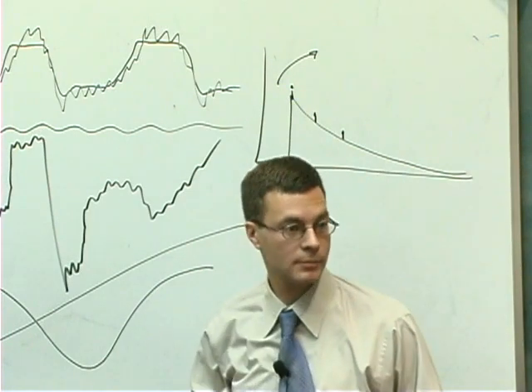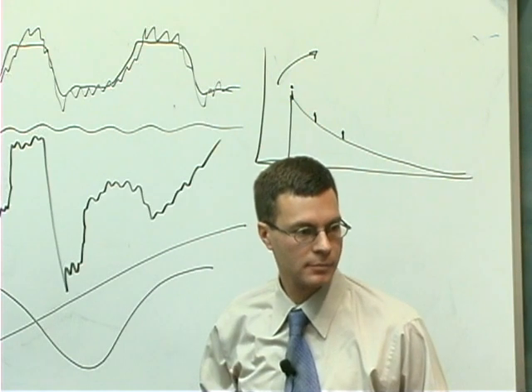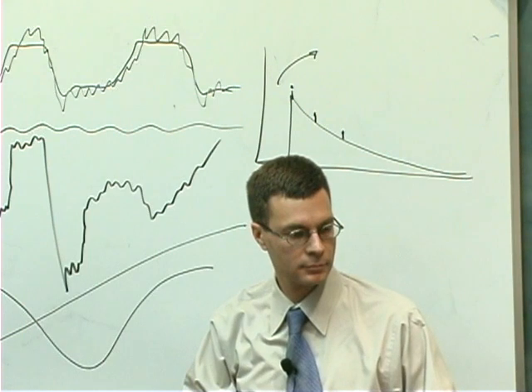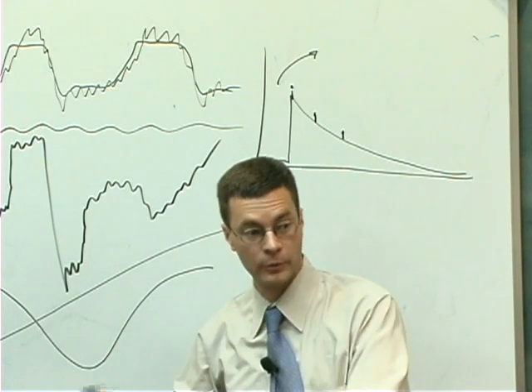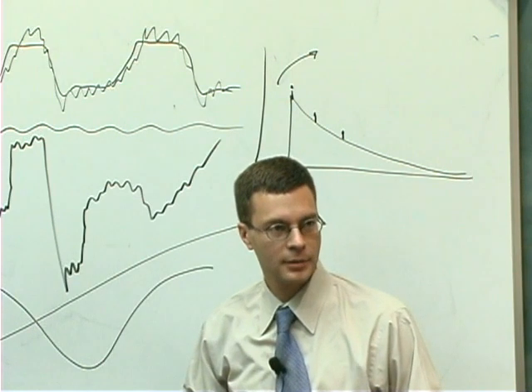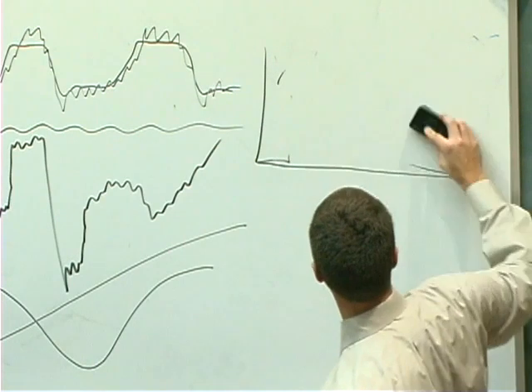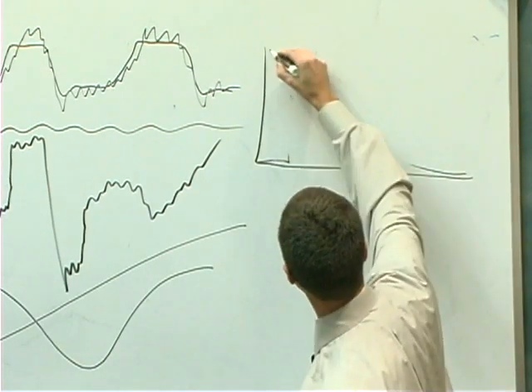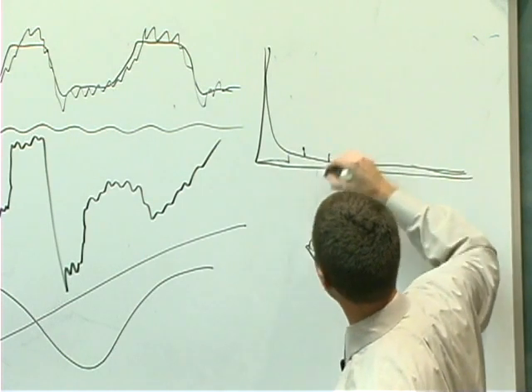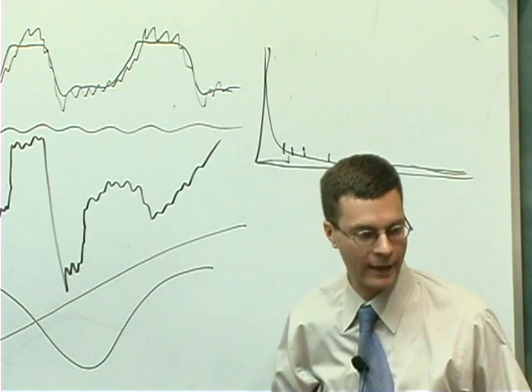Yes. When in the past, and actually this experience is, when we change the filters, it doesn't change the data. Doesn't change. You mean it doesn't change your statistical results? Well, I mean it's possible that... I've drawn a fairly extreme example here, but depending upon the experimental frequency that you use, it could be that here's the 1 over f noise power spectrum, and here's your task up here, right? So it doesn't really make much difference if you filter to this point or this point. It won't have too much of an effect.